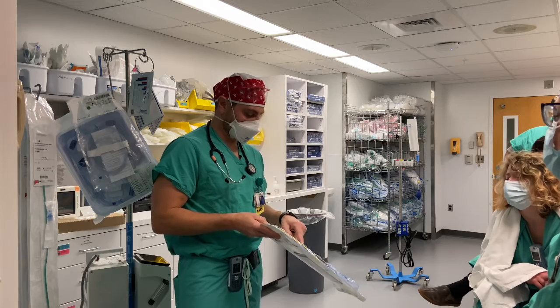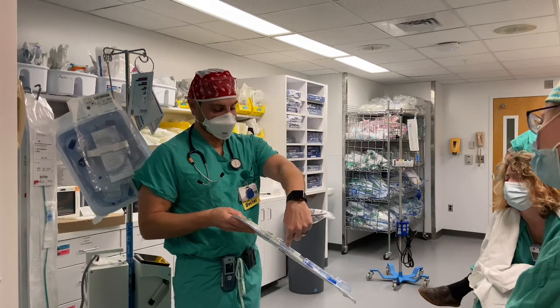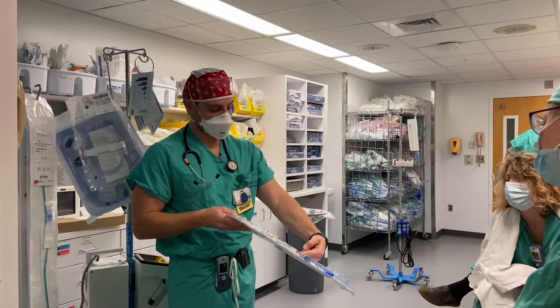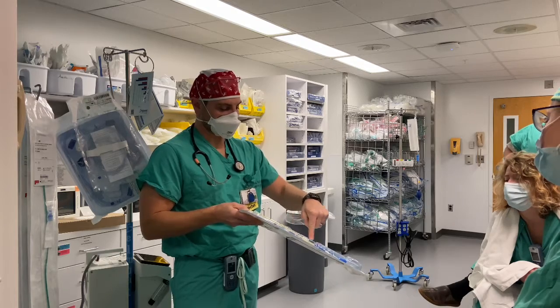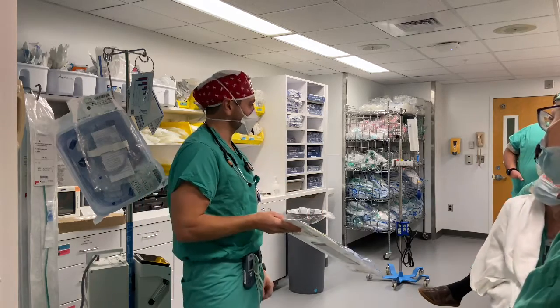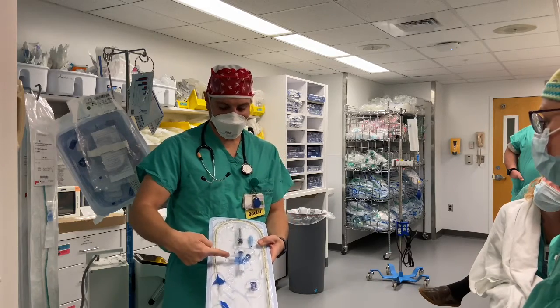This is another thing right here that's useful to get familiar with. There's 3 ports. This one hooks to the ventilator. This one hooks to the patient. So if you ignored these two, this is just a normal sort of L connector that allows you to ventilate a patient. Mind showing that this way, Justin? This way? Yeah, sure. So to the patient, to the ventilator.